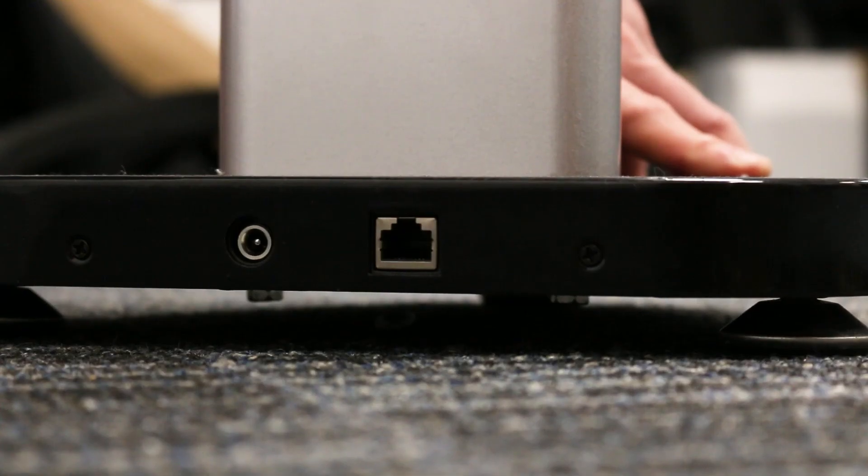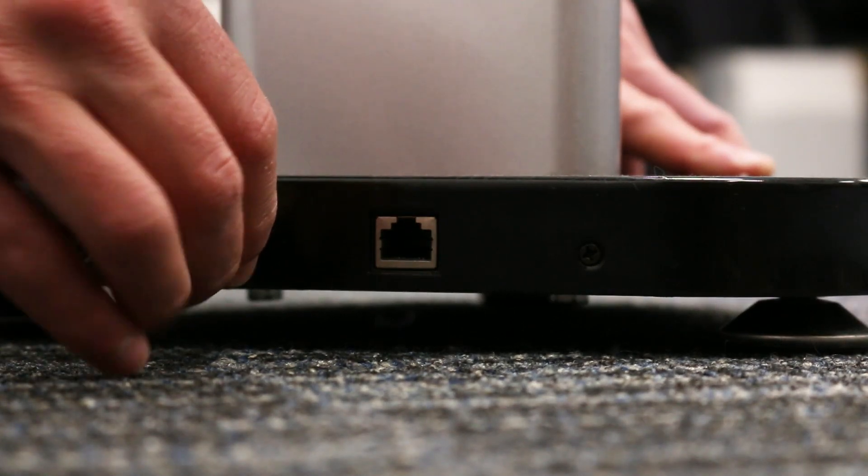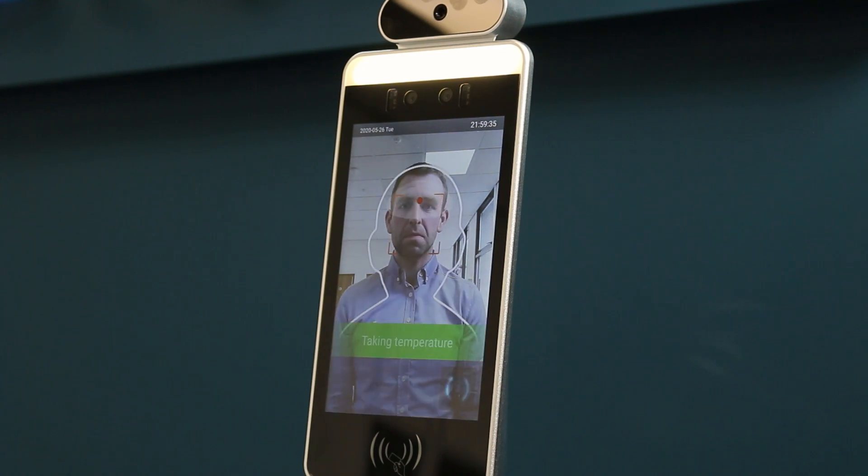The next step is to connect the power to the rear of the pedestal unit. Your device is now connected and will start temperature screening like so.